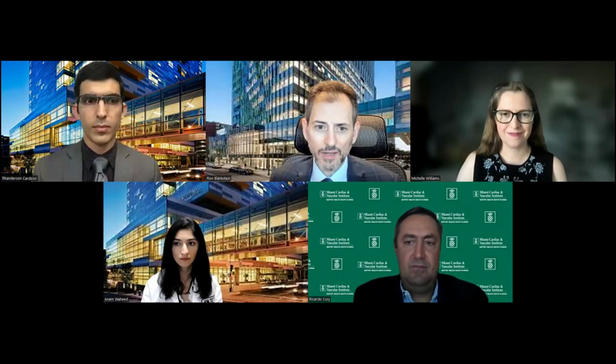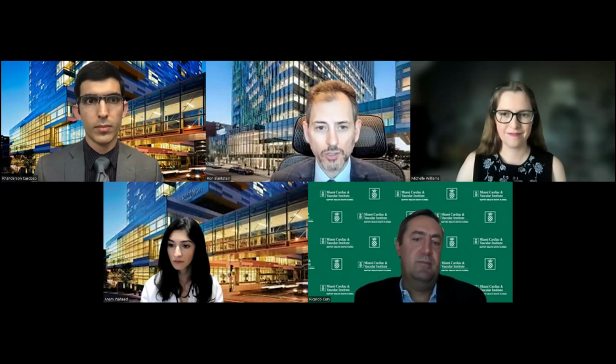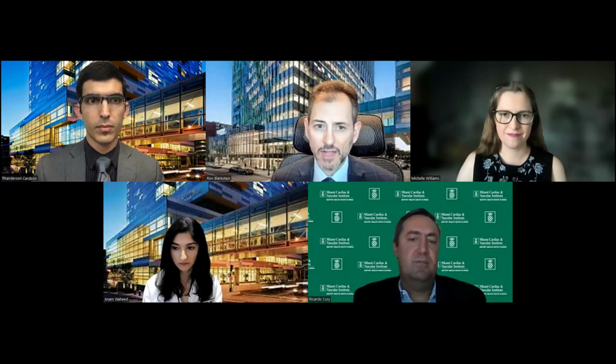I'll open it up to see if there's any other questions. If not, I'll answer another question that was sent my way about the I modifier. We talked about I+. Michelle shared with us, it's about CT perfusion and CT-FFR. What if there's ischemia by another modality, a stress MRI, a nuclear stress test? Certainly that's important to integrate as well. If you have that information, and if you're comfortable integrating that, you can in the impression say that there's, for example, severe stenosis in the left circumflex, which corresponds to the area of severe ischemia seen on a nuclear stress test. You can do that, but the I modifier is specifically to indicate that an evaluation of ischemia was done using CT. So just to clarify that particular point.